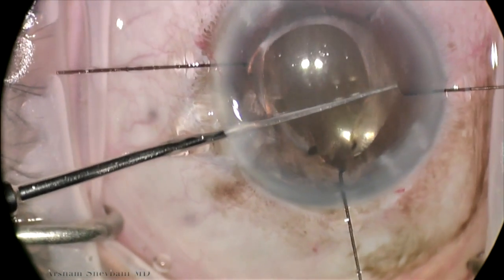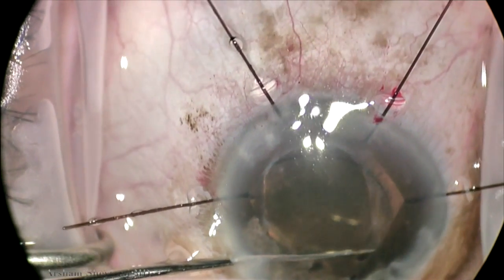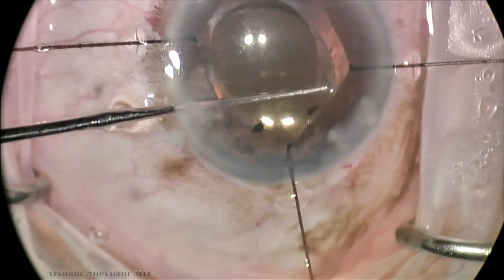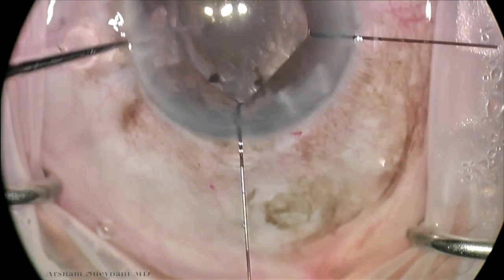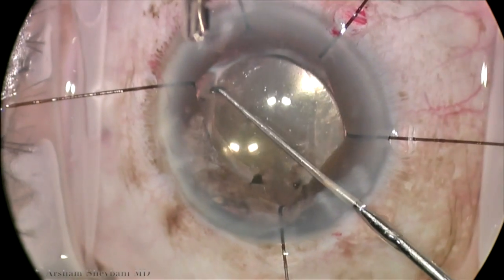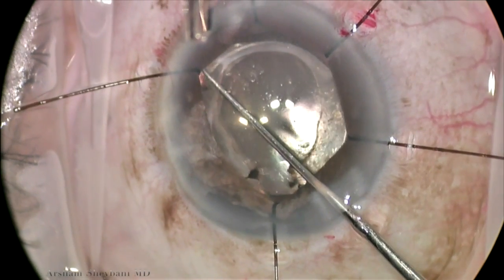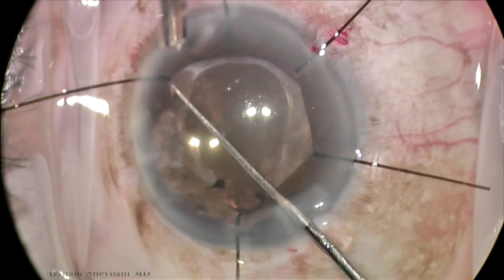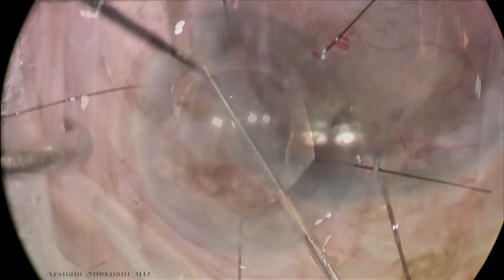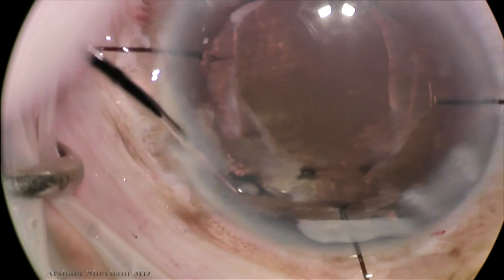We end up rotating this lens now within the capsular bag to move the haptic away from the area of zonule weakness in order to prevent it from folding upwards against that iris tissue. Once the lens is well rotated, we can actually, in the operating room, see that the haptic bulb is no longer visible through that prior iatrogenic iris root trauma or iridodialysis.